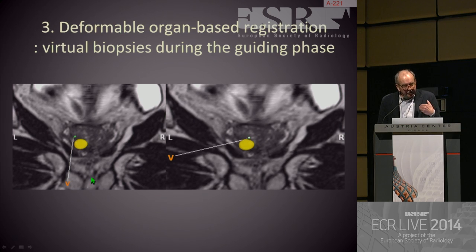But before you aim exactly at the lesion, you make a first guess. You just aim and activate. You don't activate the biopsy gun, and you have a virtual biopsy. So you're not good. Another trial, you're not good.